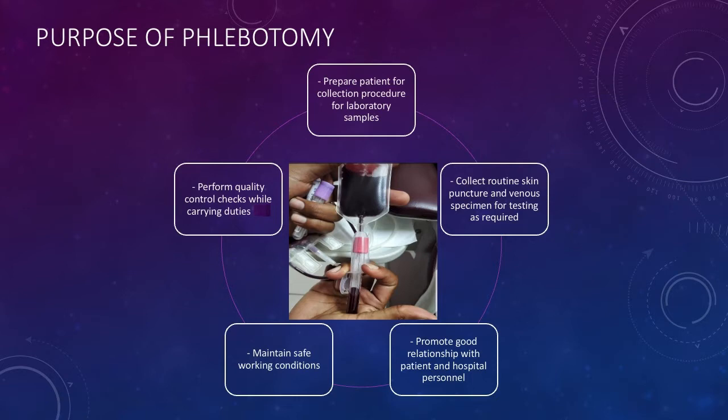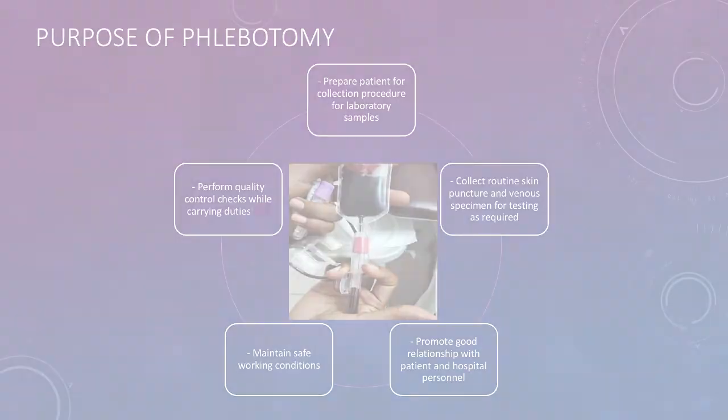Purpose of phlebotomy: prepare patient for collection procedure for laboratory samples. Collect routine skin punctured and venous specimen for testing as required. Promote good relationship with patient and hospital personnel. Maintain safe working conditions. Performing quality control checks while carrying out duties.